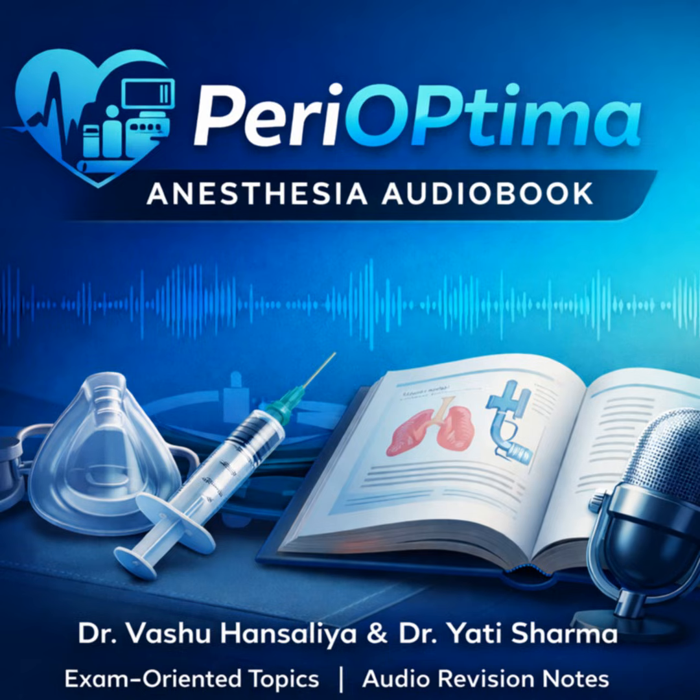So even if I try to turn the O2 completely off, the N2O flow will be mechanically limited to maintain that 25% minimum safety ratio. You can't override it. How does that contrast with the pneumatic systems? Pneumatic systems achieve the exact same goal, but they use pressure differentials and valves instead of gears. They often use sensitive O2 ratio controllers that measure the pressure drop across both the N2O and the O2 flow resistance points. If that pressure difference indicates you're trying to create a sub-25% O2 mixture, the system pneumatically restricts the N2O flow until the safe ratio is restored. So different engineering, same outcome.